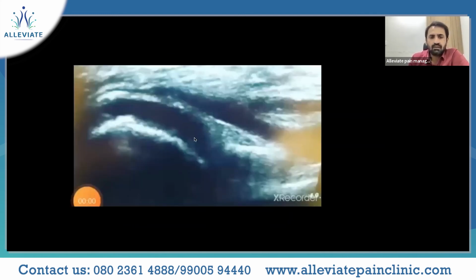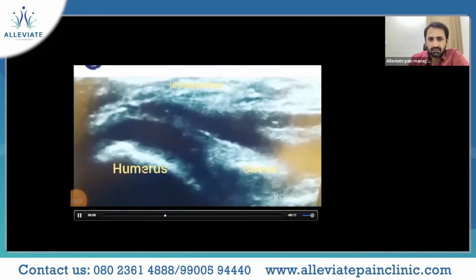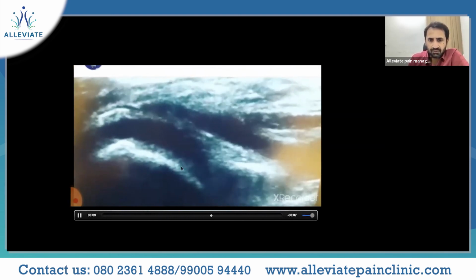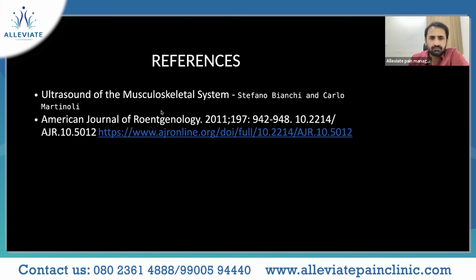Here again, you'll be able to visualize hydrodilatation of the shoulder joint, which we have done for frozen shoulder. You can see the distension, and you can see the humeral head being pushed down, and your infraspinatus is pushed up, and you can see the spread of your local anesthetic and normal saline into the joint.